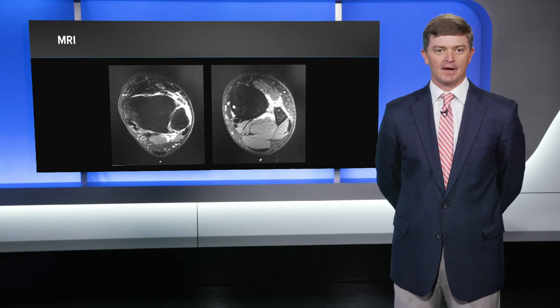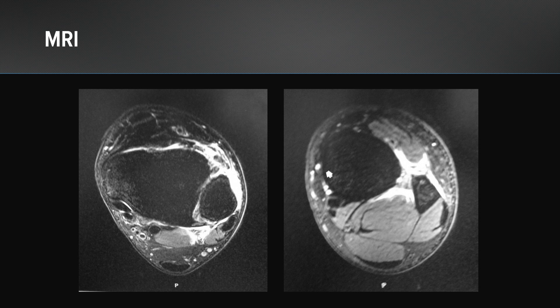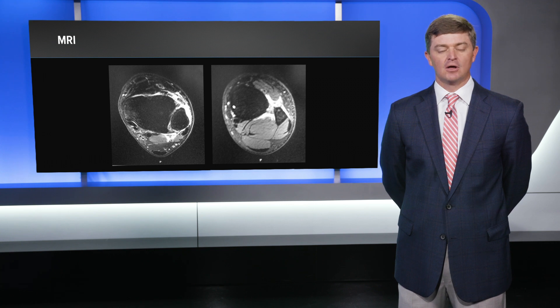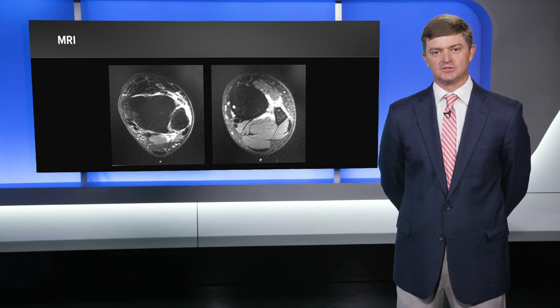So I ordered an MRI based off that algorithm that I explained earlier, and you can see here on his MRI, I'm certainly more concerned for a more significant injury. On the left side of the screen, you can see the edema around the syndesmosis, and the AITFL is completely torn. You can see the fluid extending out of the back of the PITFL. When I see the fluid extending out the back, as you can see here in the FHL, I get concerned that there's been a tear posteriorly and there's been a compromise to the normal soft tissues posteriorly.